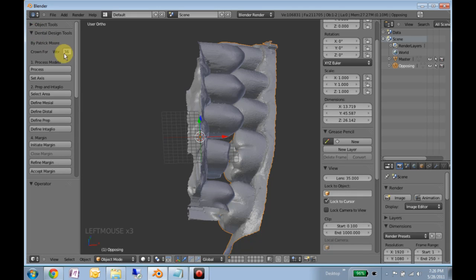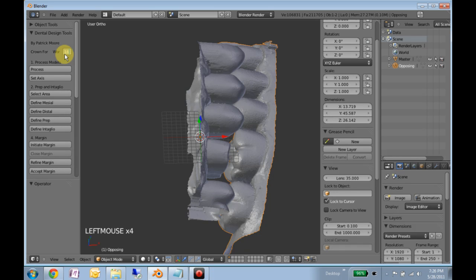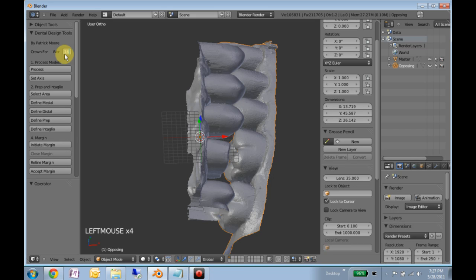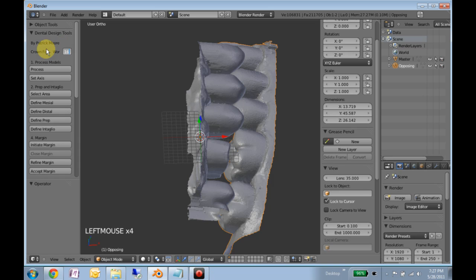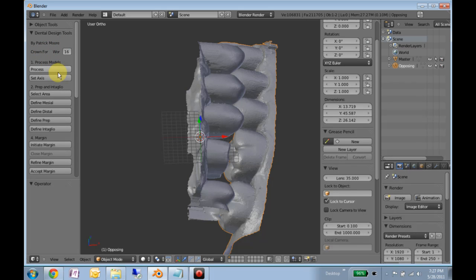Open up the design tools. Tell it what tooth you're working on. And this is the quadrant tooth system. So 1, 6 is the first quadrant, 6 tooth back, or the first molar. It's not the 1 through 32. That can be changed, and I'll probably update that where you have a little check box whether you're working the international or the universal.